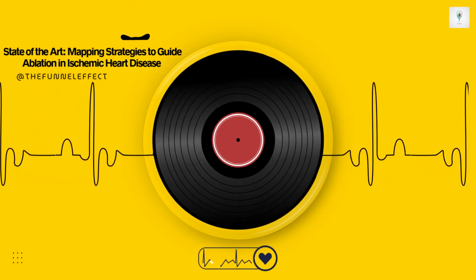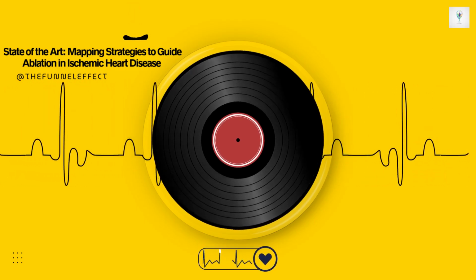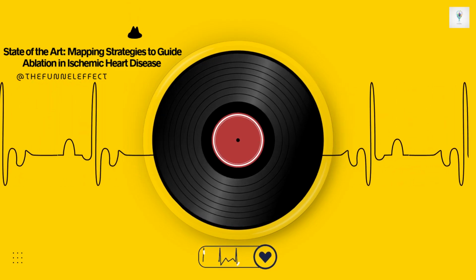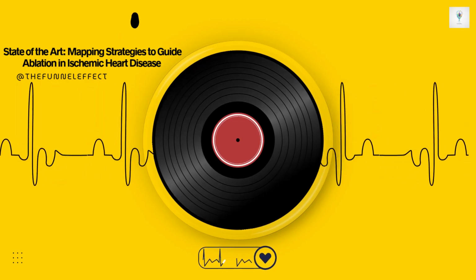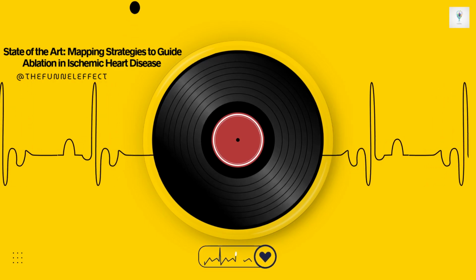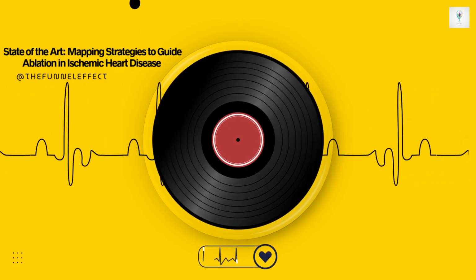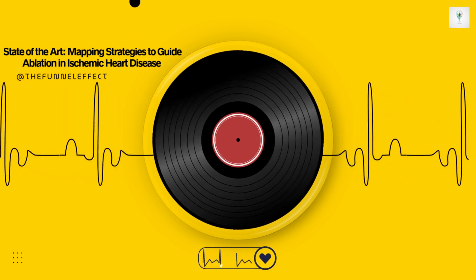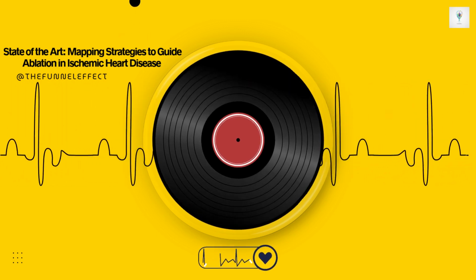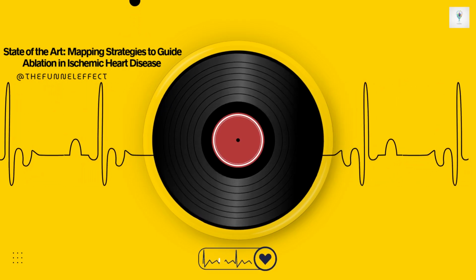Okay, let's dive into that first main strategy, substrate mapping, finding those architectural danger zones while the heart's in a stable rhythm. And the absolute foundation for this, historically and currently, is voltage mapping. That's right. It starts with mapping the electrical landscape using bipolar voltage. This measures the signal amplitude between 2 very closely spaced electrodes on the catheter tip. Generally, lower voltage means less healthy, viable heart muscle under the electrode, more scar, less signal.